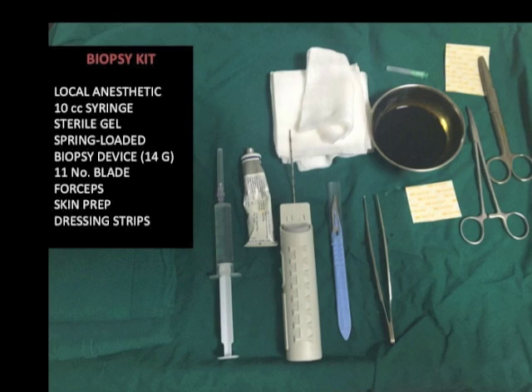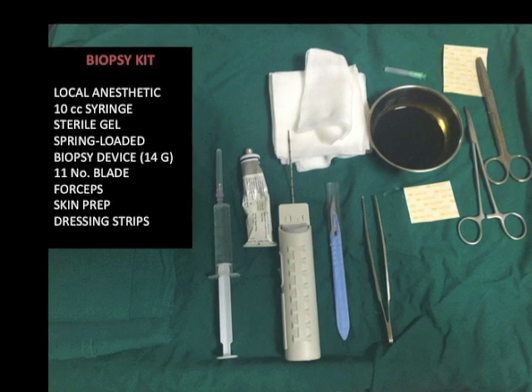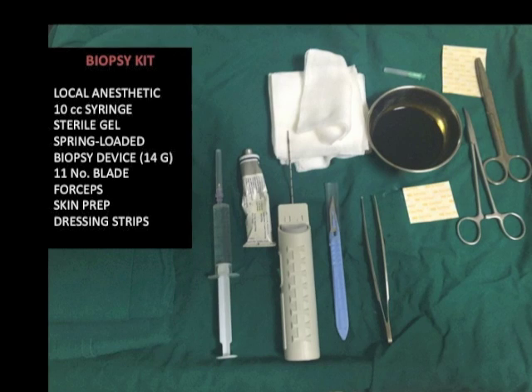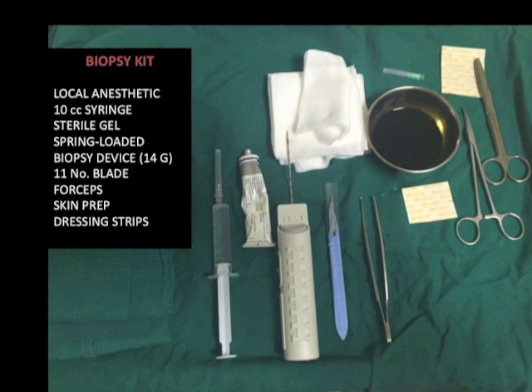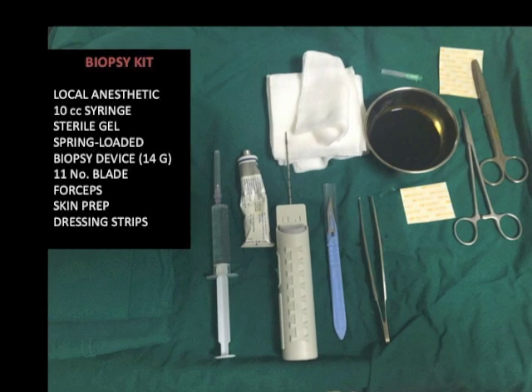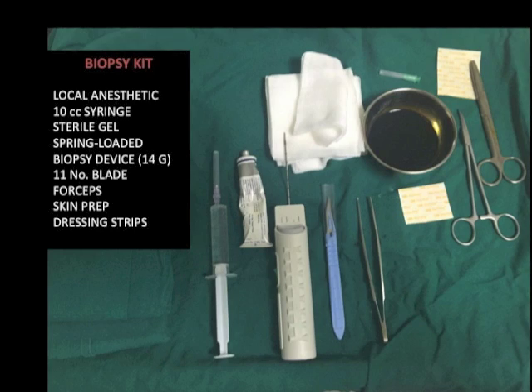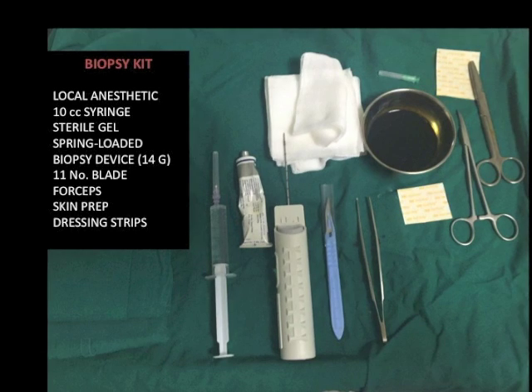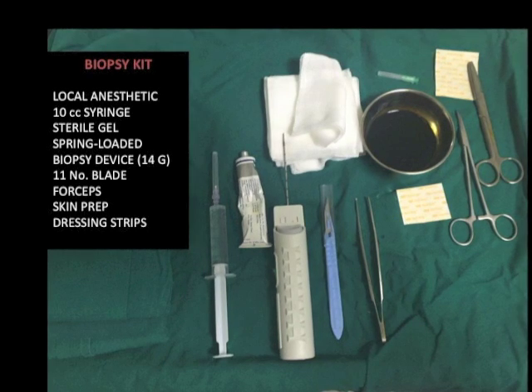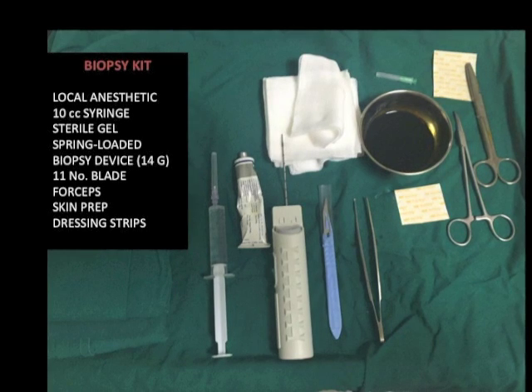These are the supplies we use: a syringe to infiltrate local anesthetic, a spinal needle is used for more distant lesions, an 11 blade, a spring-loaded 14 gauge biopsy needle, some gauze dressing strips, and 10% buffered formalin for collection of the specimen. I use a sterile glove instead of the ultrasound probe cover and lignocaine jelly in place of the sterile ultrasound gel.